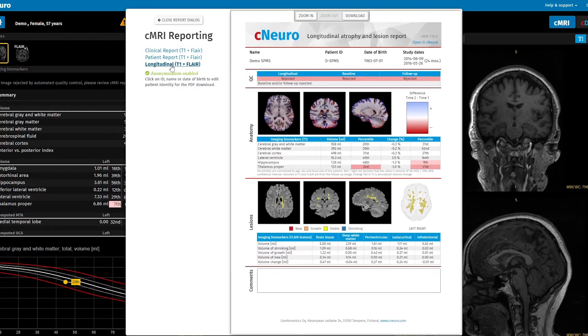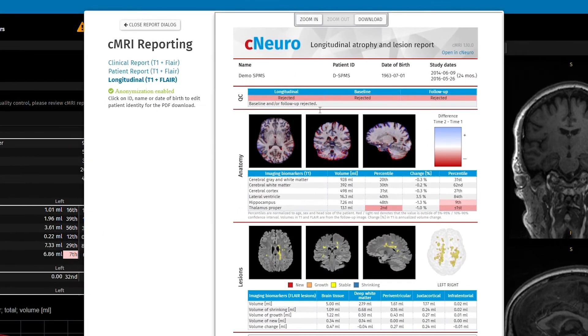If you review this in PACS, you can simply click Open in CNeuro to open the viewer.